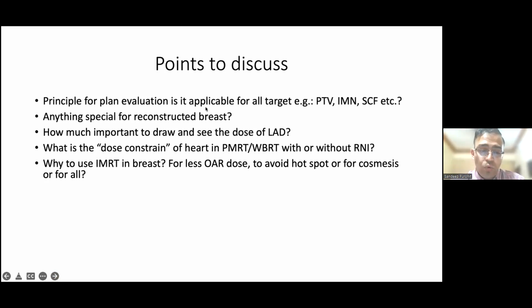I mean, with the whole breast RT, when including internal mammary nodes, I see most of this medial tangential going through the heart. But with post mastectomy, I think, sir, in all the patients, we follow the DIBH. If a patient is not able to get DIBH, then we go for IMRT. And with IMRT, sir, there is no problem with the tangential.